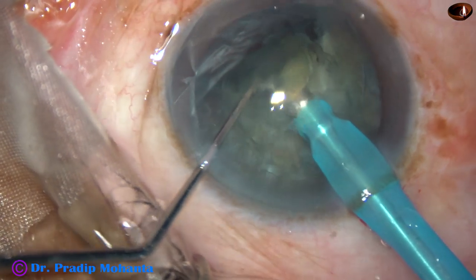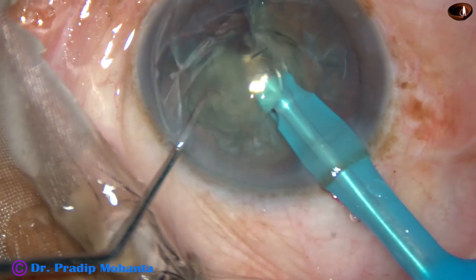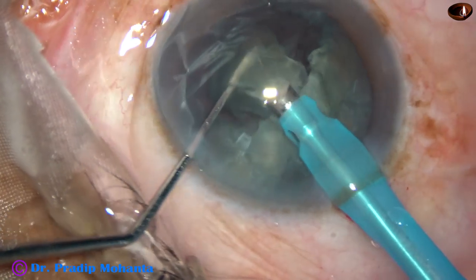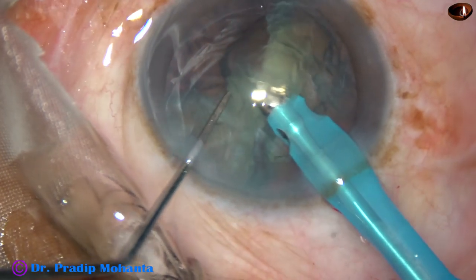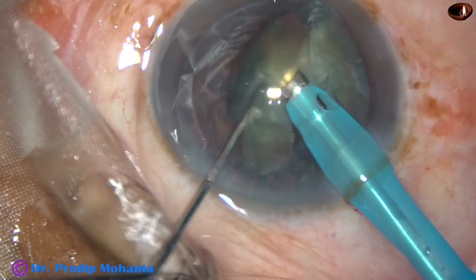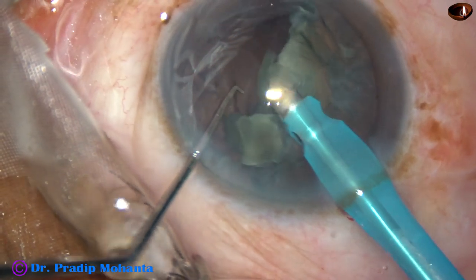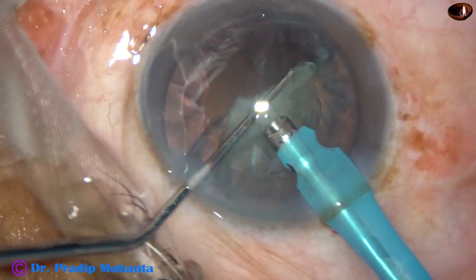This free nuclear fragment is emulsified. Another fragment follows. The phaco power — that is, ultrasonic energy used in this case — is 60%. Flow rate is 40 ml per minute. The vacuum is 400 mmHg. This is phaco chop from Oatley.